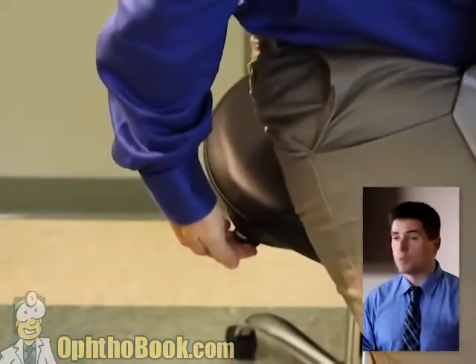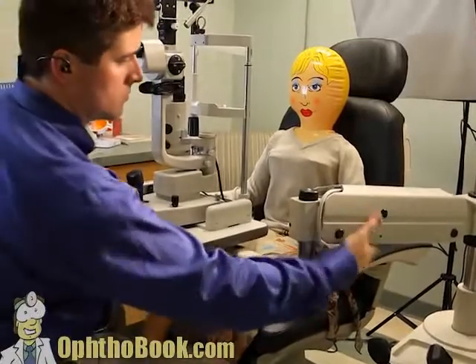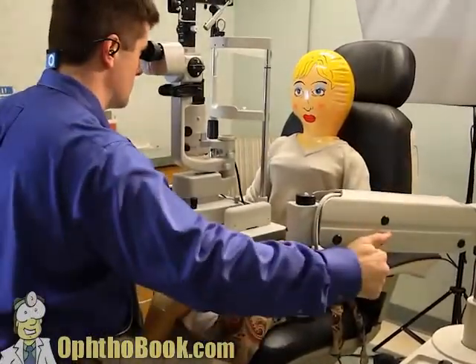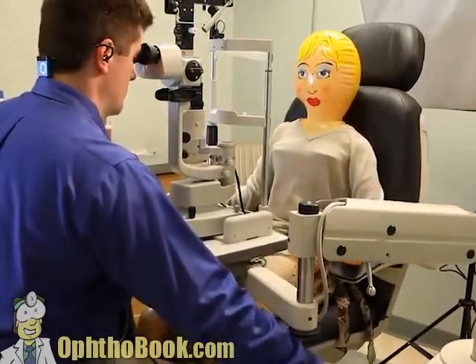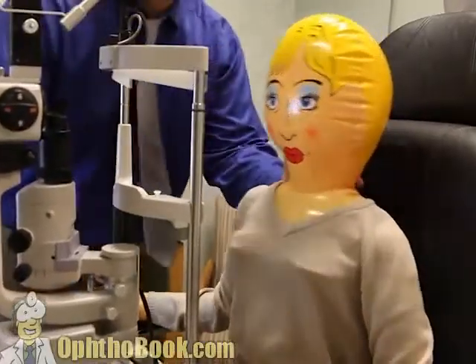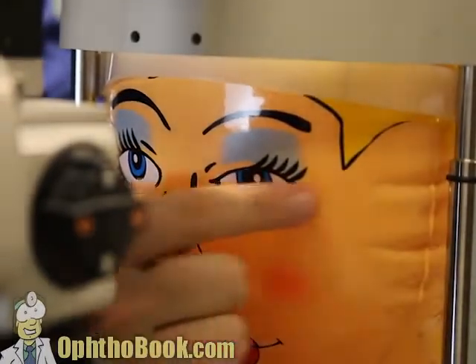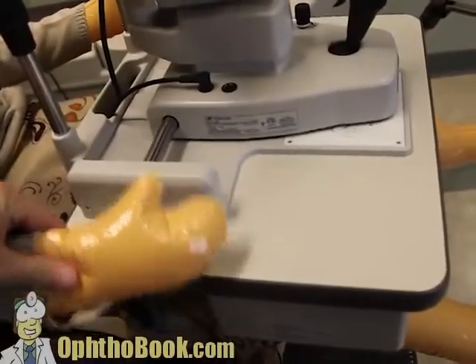So that means setting the seat where you want to sit. Once that's set, then you can set the microscope at the height that you like, and there's usually a locking mechanism here to the side. And only then do you start worrying about the patient and set the patient where they're comfortable as well. We can raise the chair here, and of course our goal is to get our patient's forehead against that bar, chin on the chin rest, and you want to line up the lateral canthus of the eye with that black mark in order to get the maximal excursion and get them doing well.